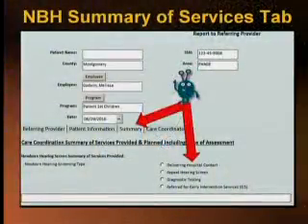So this is a fantastic case, not only because of the child's name, but also because the child has passed the hearing screen in both ears, and the parents are not going to have to worry about any follow-up appointments related to the hearing screen. So this is what you're going to do. You create your referral, you go in and you select summary. Then you see delivering hospital contact.